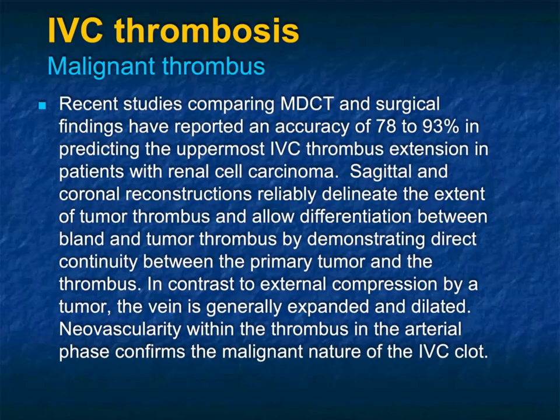Now, recent studies comparing CT and surgical findings show a very high accuracy for CT with sagittal reconstructions and coronal reconstructions in 3D. We actually published a paper which showed basically 100% accuracy.